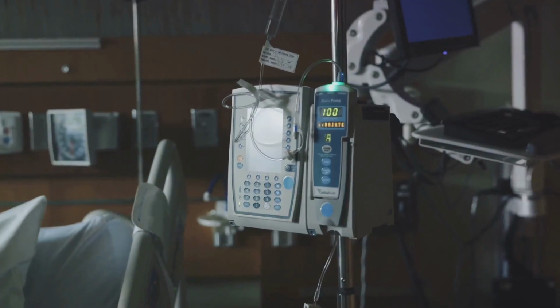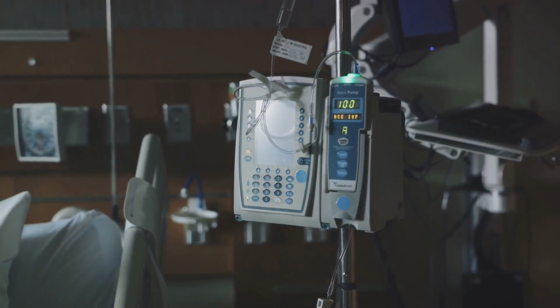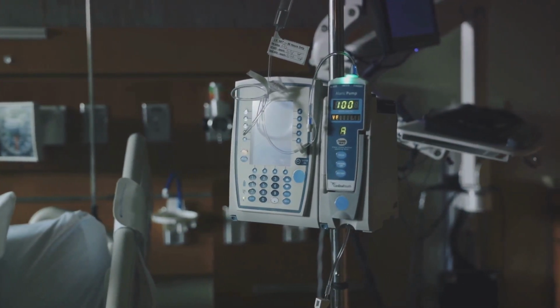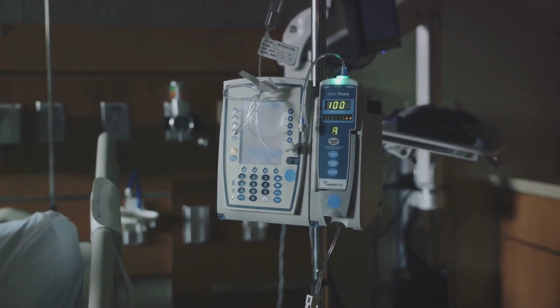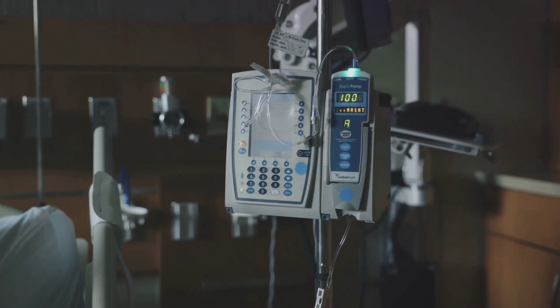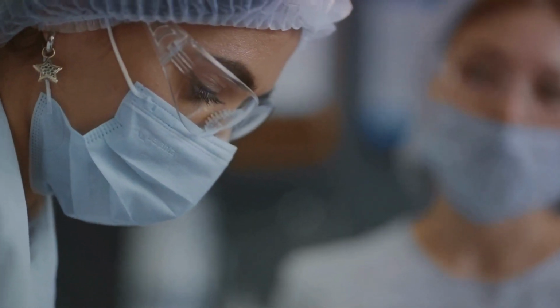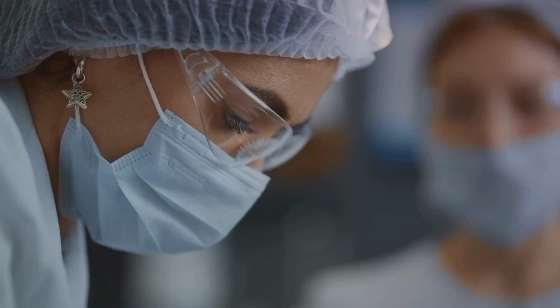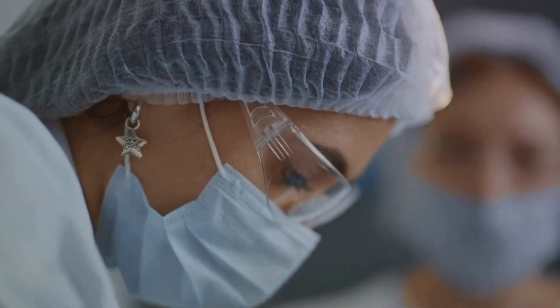Next, it's essential to have a solid understanding of the equipment. The video laryngoscope is a complex tool, and it's vital to know its parts and their functions. The blade, the camera, the light source, and the screen all play a crucial role in making this device an indispensable part of the intubation process. Remember, skillful handling of the equipment can only come from thorough knowledge and practice.